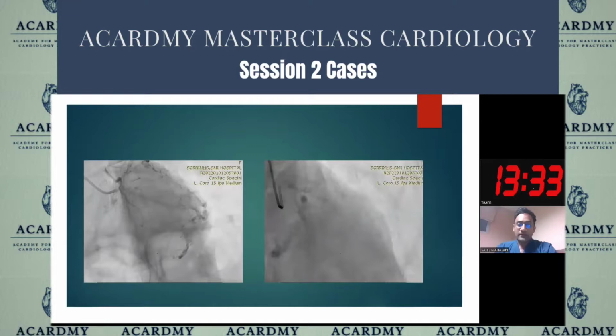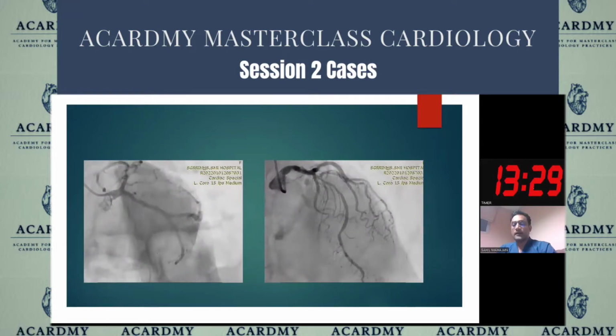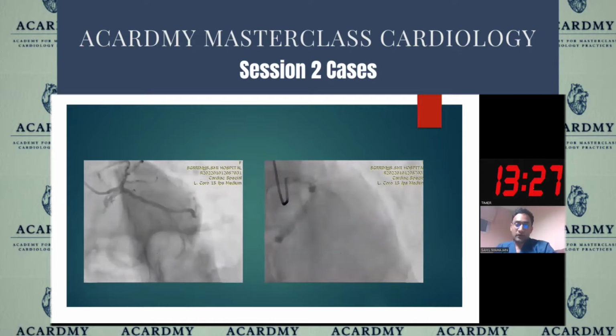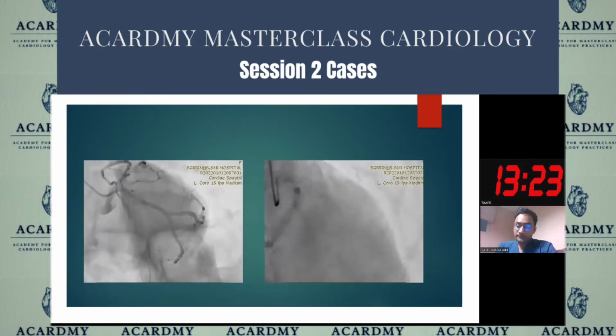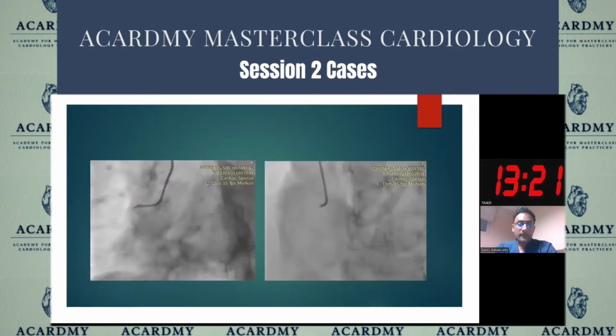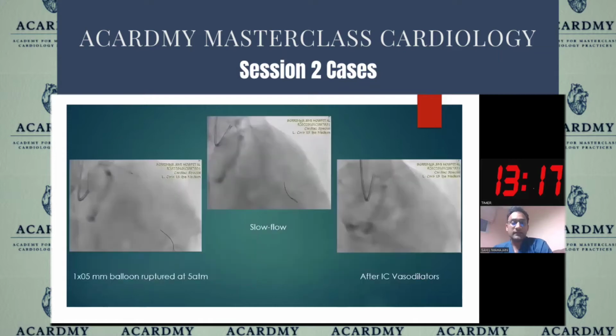This is the coronary angiogram, which showed a minor disease in the distal left main, and the proximal to mid LAD had a long calcific disease. RCA was unremarkable. There was minor disease distally only.